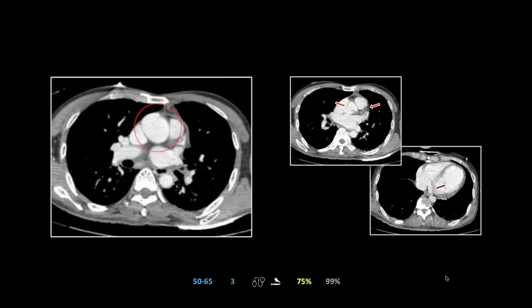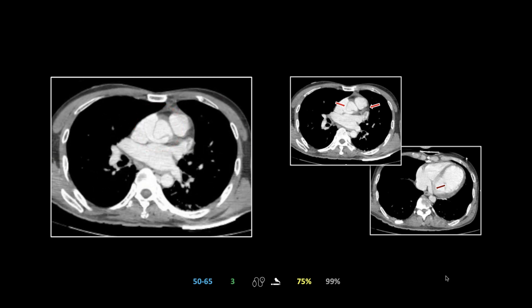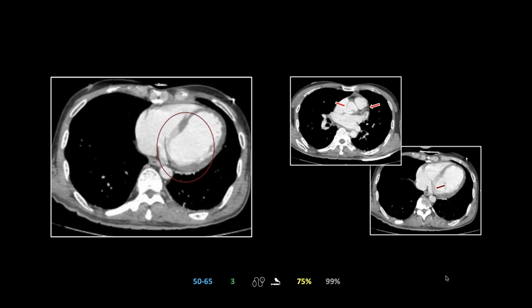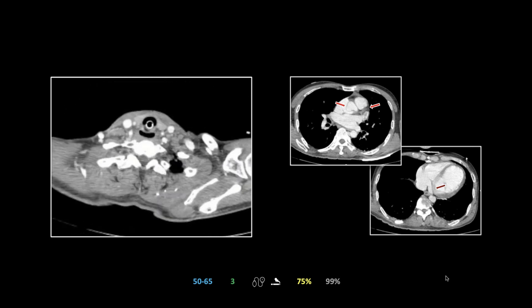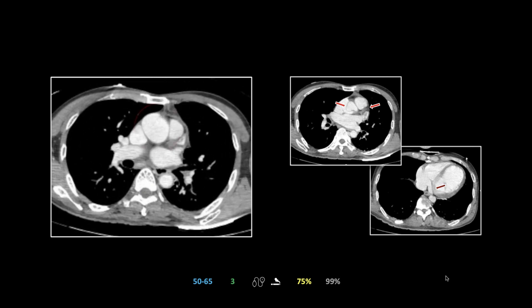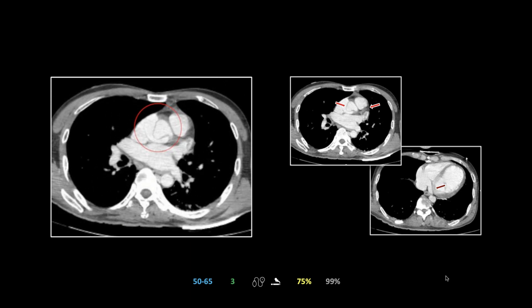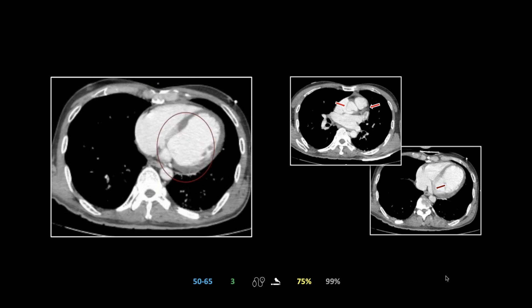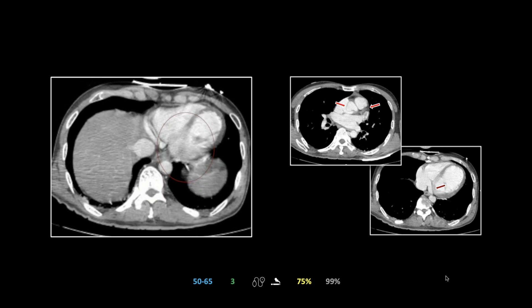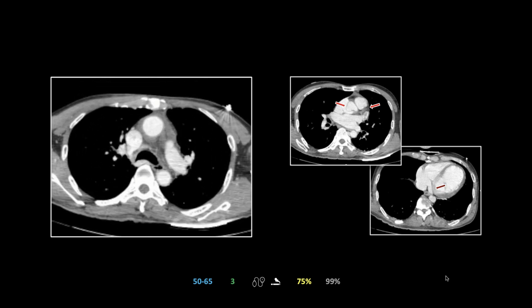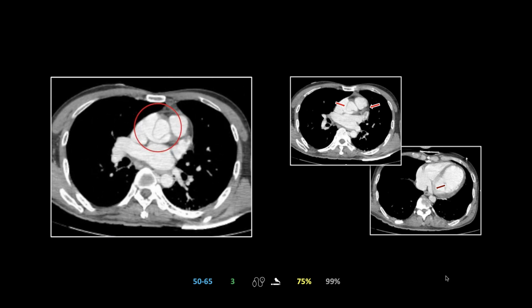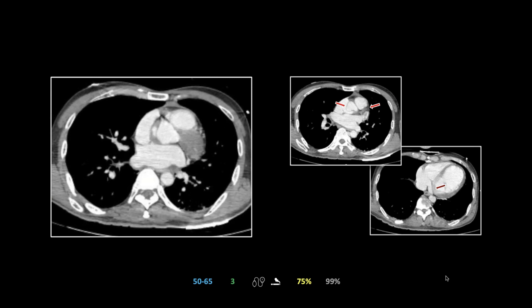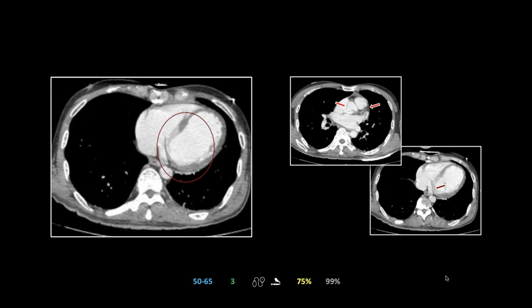On the movie track, that left aspect of the dissection flap crosses the coronary ostium, and there is that non-enhancing left coronary system with just a little retrograde fill seen later on. There is the perfused posterior basal portion of the myocardium. The under-perfused left ventricle is already starting to dilate. You'd also be drawn to this by the stranding in the superior mediastinum and anteriorly — even if the flap weren't so distinct, you'd know something was happening.